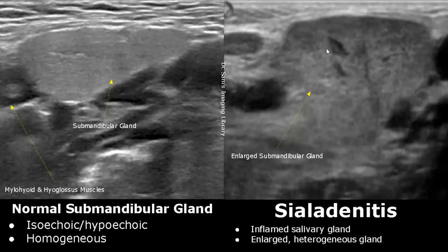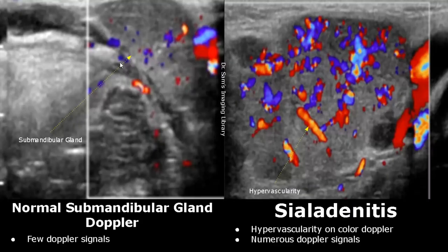The left image shows a normal color flow pattern in the submandibular gland — we only find a few Doppler signals. Whereas in the case of sialadenitis, we see hypervascularity within the gland, with more Doppler signals found inside it.